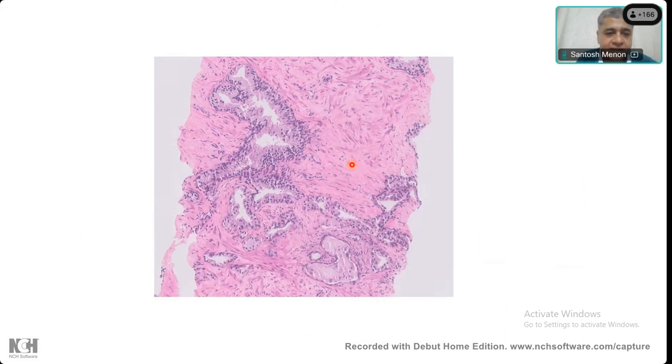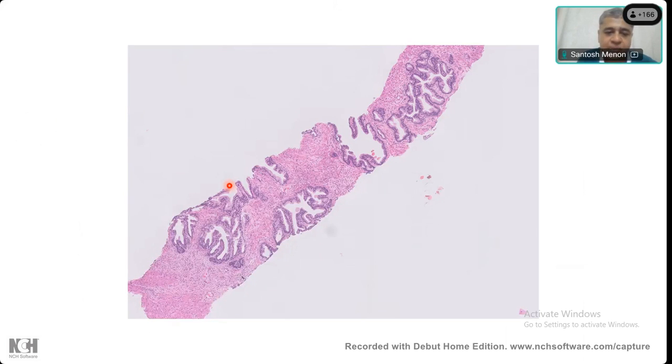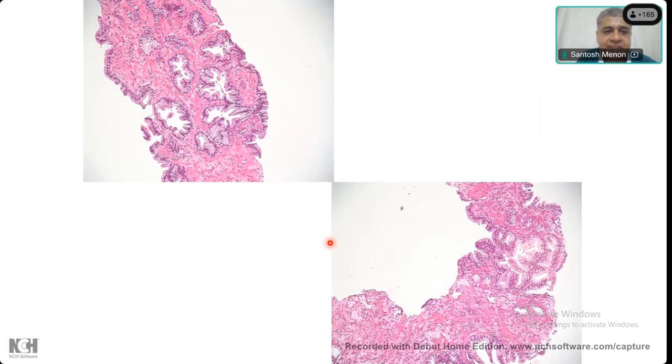Okay. Again, everybody agrees these are benign glands. Large glands, stellate lumen, and maybe some bilayering at these places. You can see the luminal as well as the basal cells. More pictures to show you the benign gland. See, they all look like families. They are all together in a family. And when do you start suspecting prostate cancer? Any idea? Again, benign glands, everybody agrees? Yes.